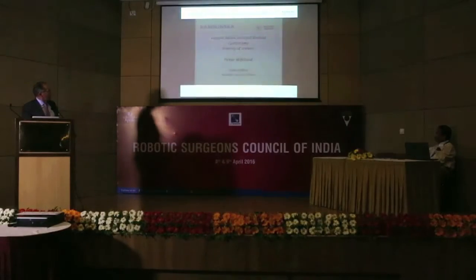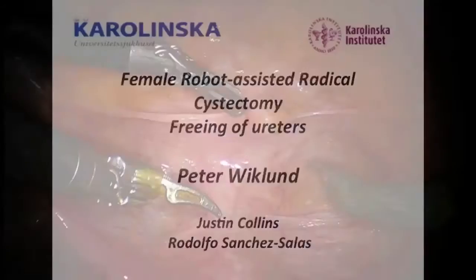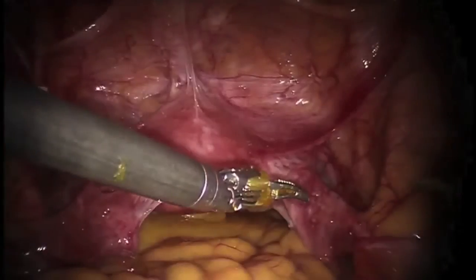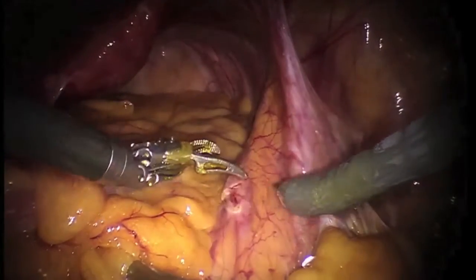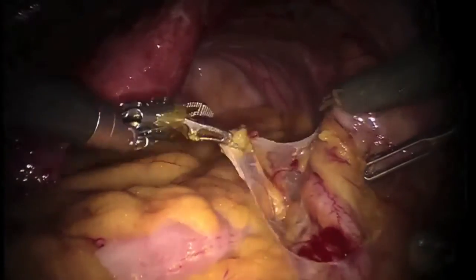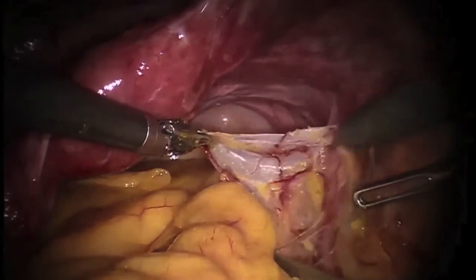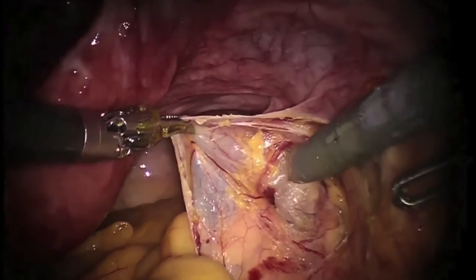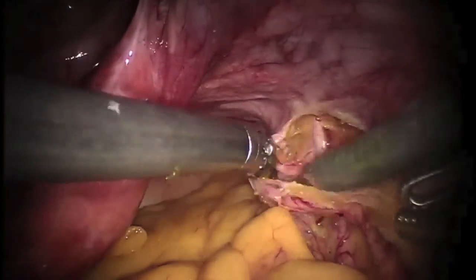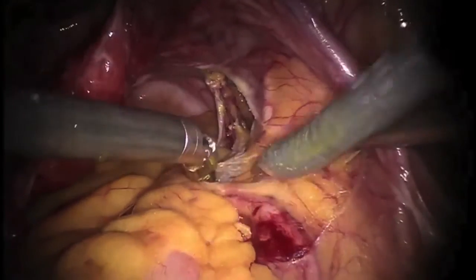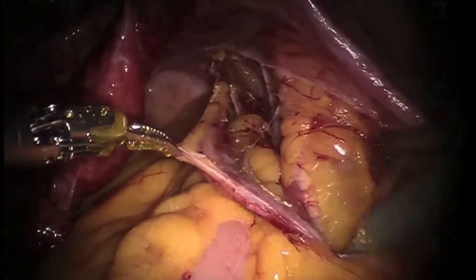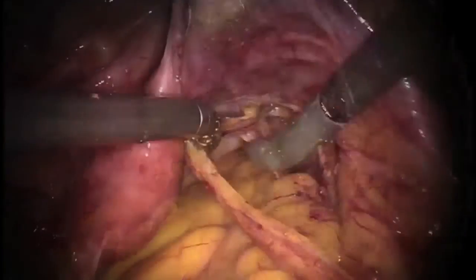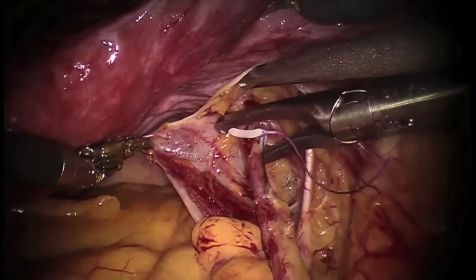The female cystectomy is slightly different. In females you can do different types of cystectomies — here we see the standard cystectomy where you also take out the female organs, the uterus and ovaries. We start exactly the same way as in a male, dissecting the ureters starting on the right side. We always start on the right because the sigmoid is on the left, and in most patients it already holds itself to the left, so you have a natural retractor. You want enough periureteric tissue for good vascularization and ureter length, but not too much to spare any tumor.